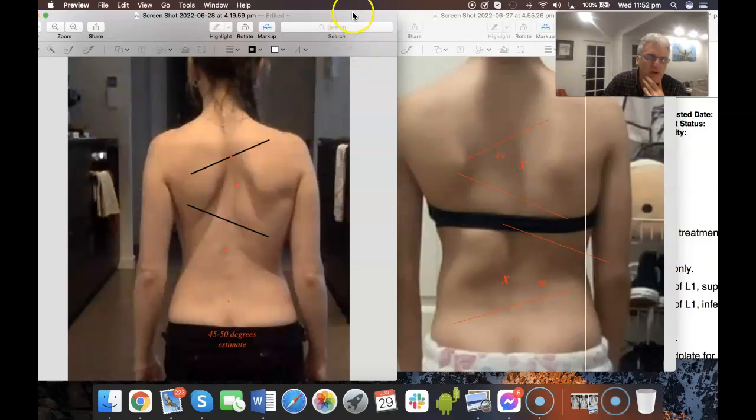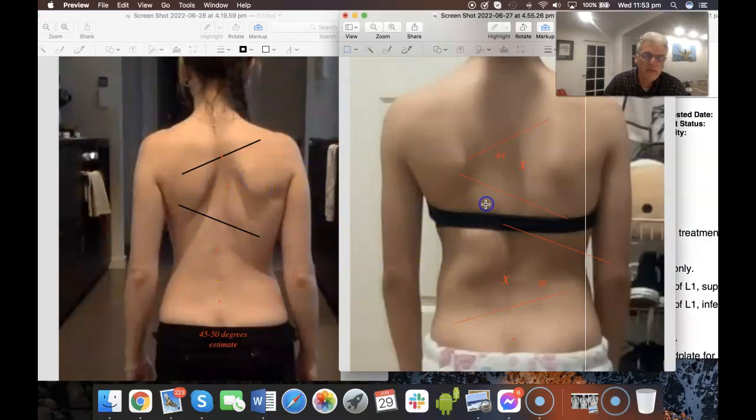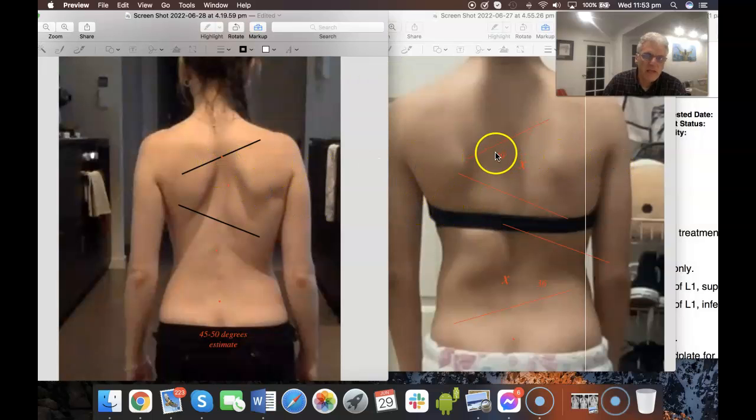These sort of postural photos here aren't good enough, but they do give you a guide in between x-rays, and the eye is actually an important measuring tool. What you can take a look at is waist, shoulders, shoulder blades, and also the angulation of the spine itself. And this young lady here on the left and this one here on the right hand side have 57 and 54 degree or 52 degree scolioses now as well.